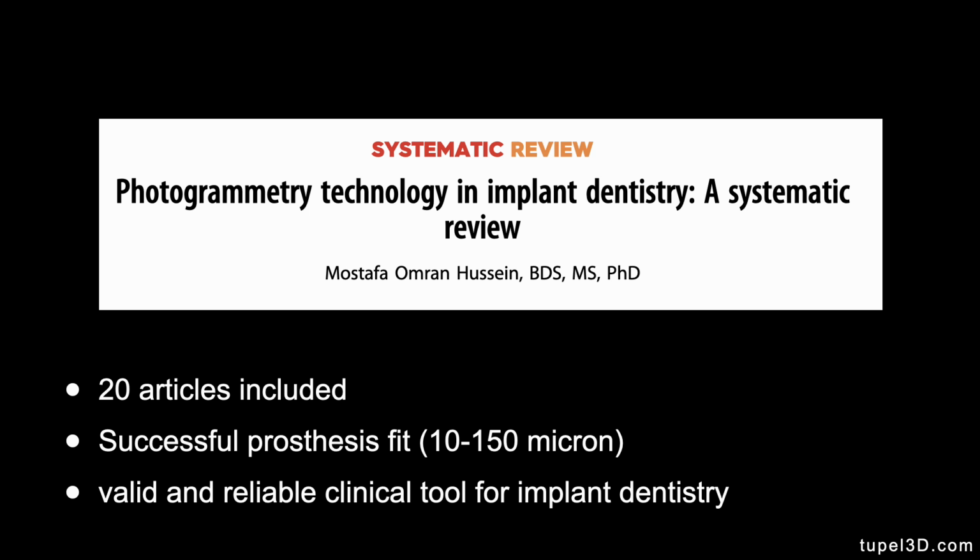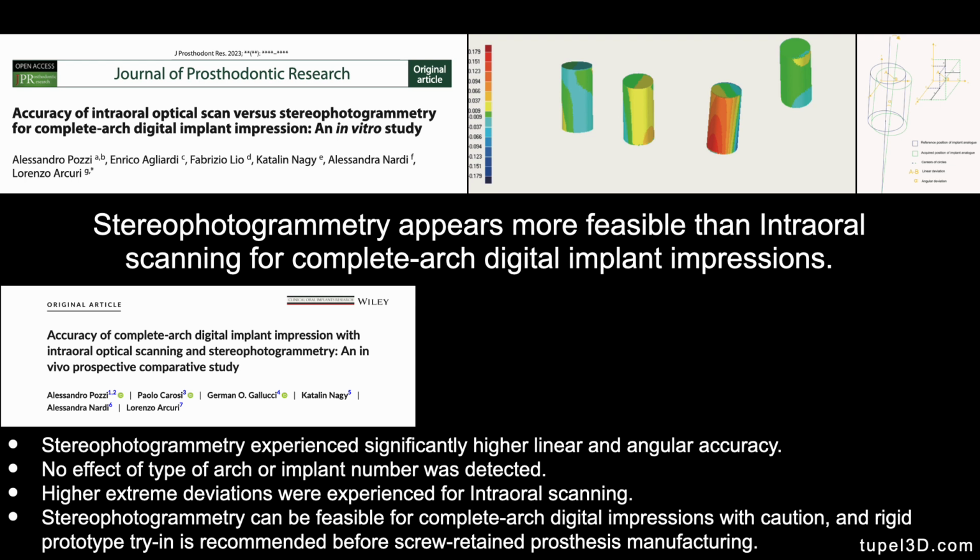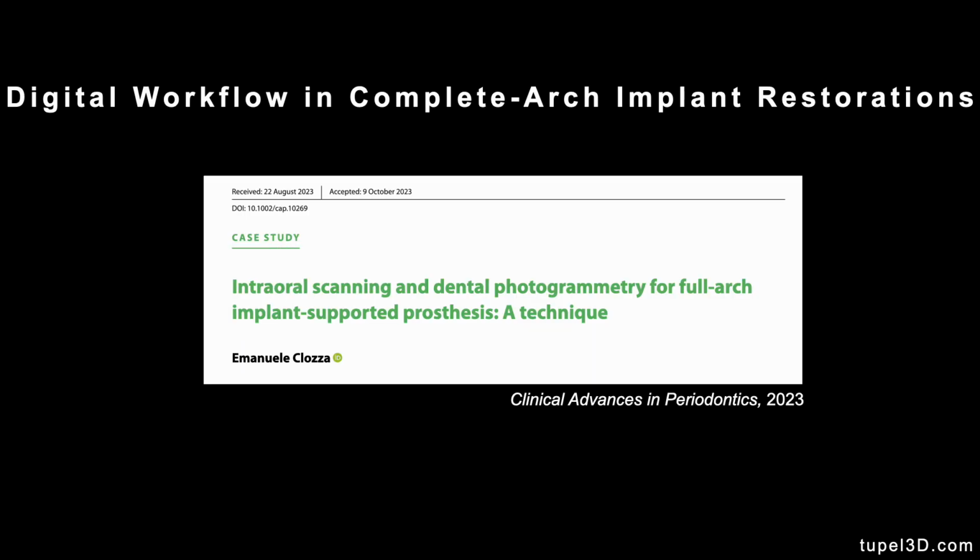Photogrammetry is a well-established procedure now. There's a systematic review that has reviewed more than 20 articles, and I think now there are even more than that. They're all claiming that we can achieve a successful prosthesis fit, and it is a valid and reliable clinical tool for implant dentistry. Most recently, we demonstrated that photogrammetry is more feasible than intraoral scanning alone for complete arch digital impressions in vitro and also in a clinical study.